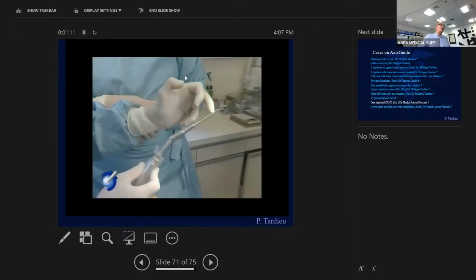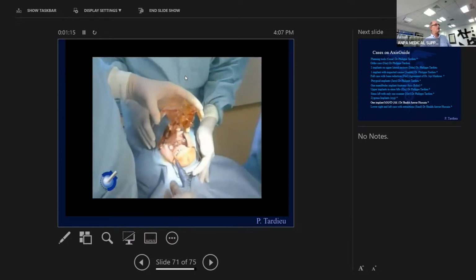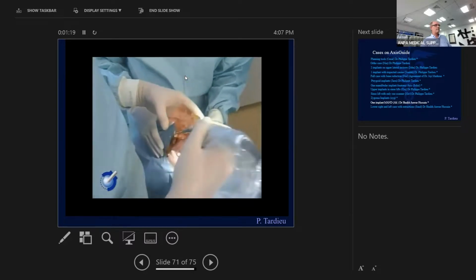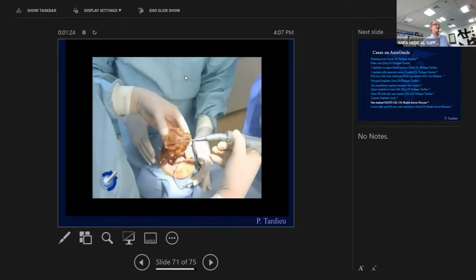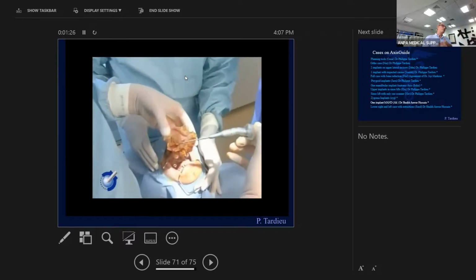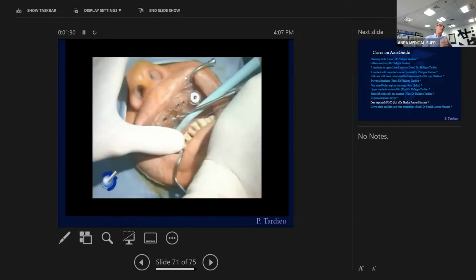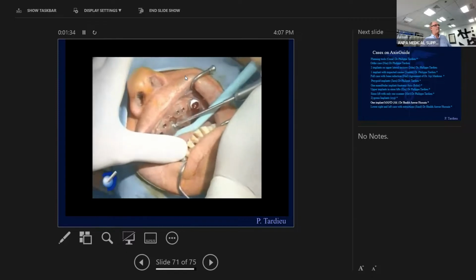And this is the special handpiece and drill I have to drill the Zygoma. So I'm angulated, and I'm going to show you how, 20 years ago, we used to do it. So now we stabilize the guide, and we have a marker telling us at what depth we are.